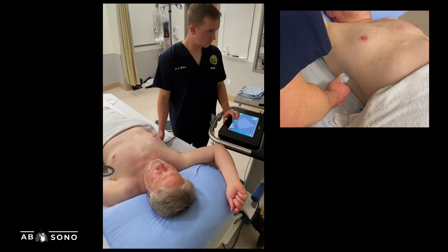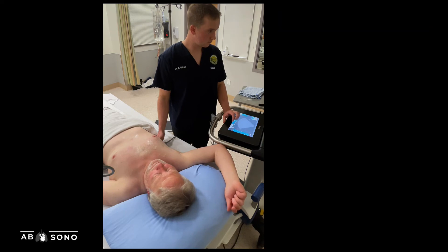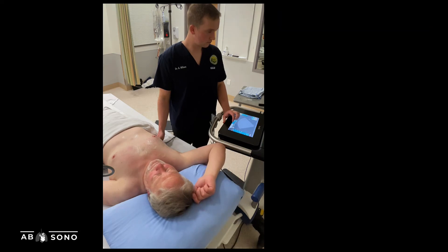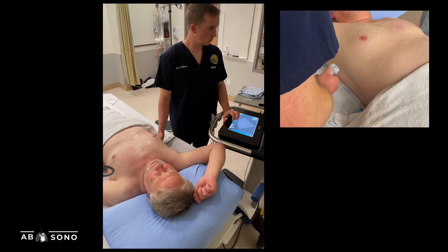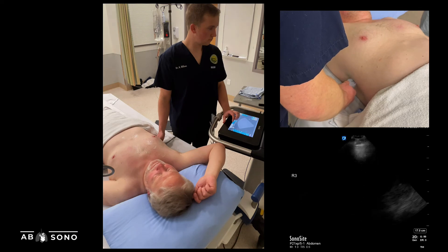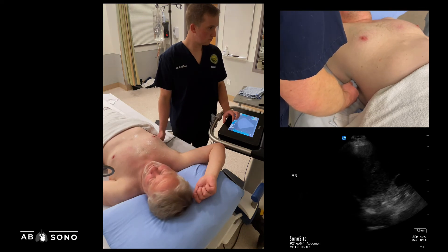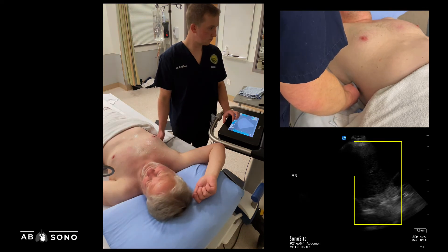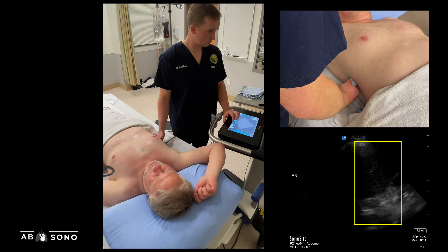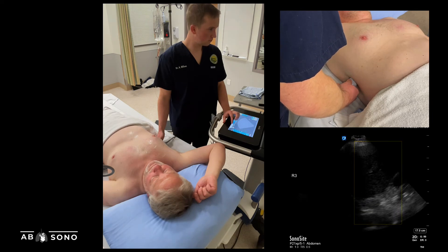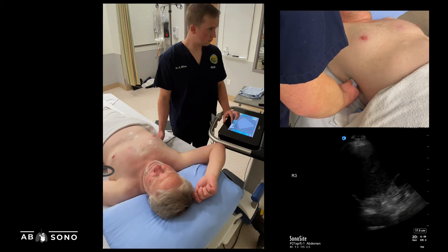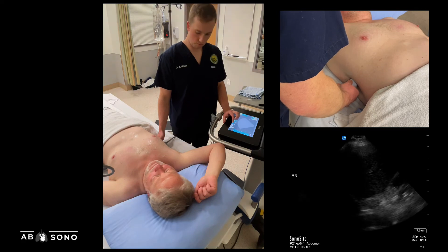Slide the probe either caudad or cephalad so that both the intra-abdominal solid organ — either the liver or the spleen — and the lung are well visualized. The respective solid organ should occupy the rightmost third to half of your image. If too much of your image is occupied by the spleen or liver, correct this by sliding up one to two intercostal spaces.